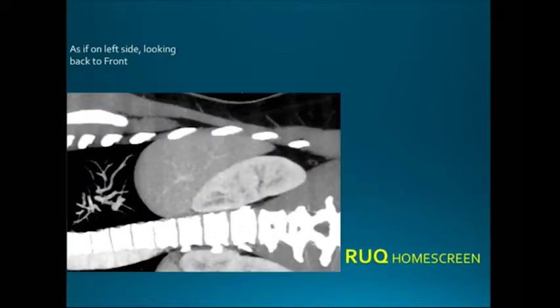So how do you do this? This is not going to project well, unfortunately. I apologize in advance, but we use the liver as the acoustic window, and we use the same view that they do in a FAST scan for trauma. We shine the beam through the liver, through the kidney, and then hit the vertebral bodies about here, and we'll angle posteriorly. And in a person who's supine, that fluid will collect between the kidney and the liver.